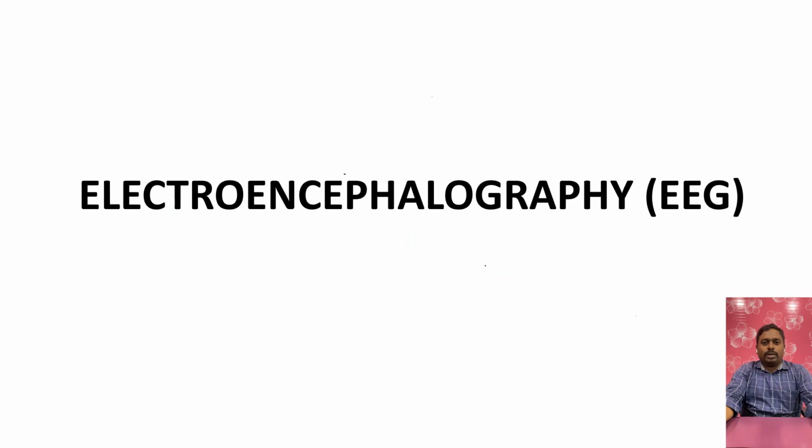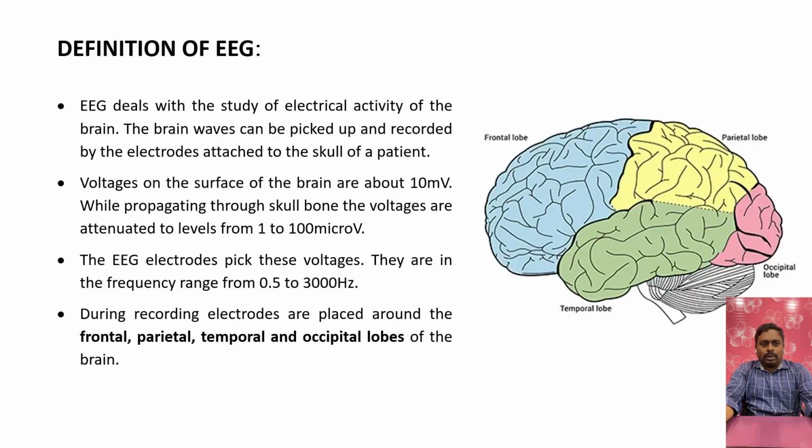Basics of Biomedical Instrumentation course. Today, we are going to discuss electroencephalography. It means EEG. Definition of EEG. EEG deals with the study of electrical activity of the brain.